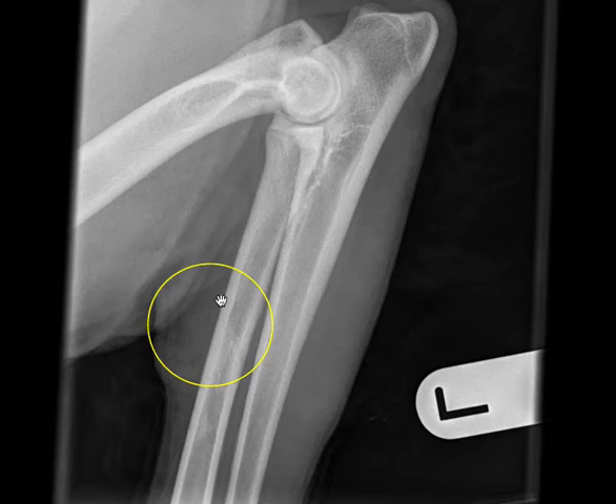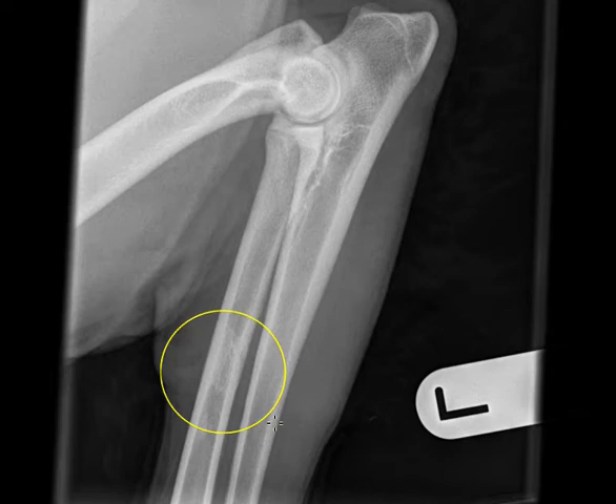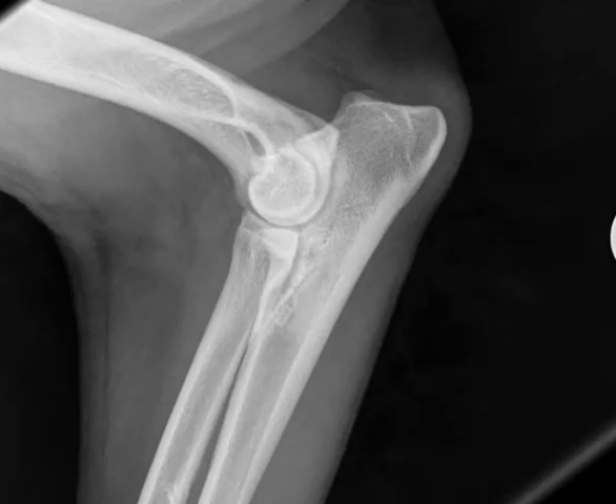You can see this is characterized by a change in opacity. The normal medullary opacity that's a little more radiolucent than this circled region — the normal medullary opacity is partly more lucent because the medullary cavity contains fat. So when I start to see increased opacity, I think about tissue in this area that is now no longer fat but soft tissue. This can be from cells, inflammation, hemorrhage, etc. Those would be my main findings on this view.